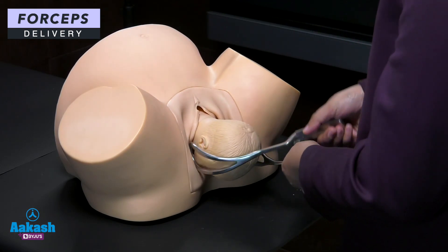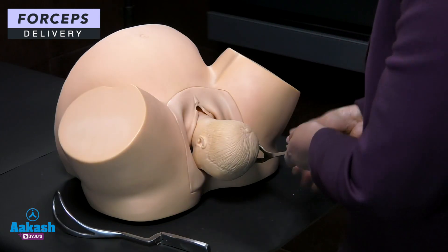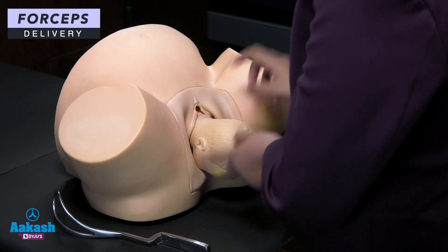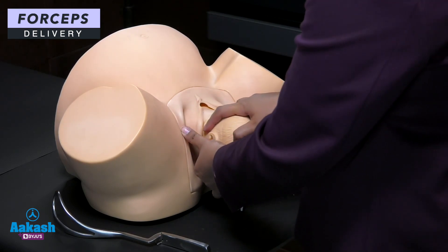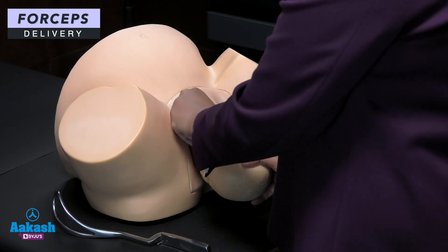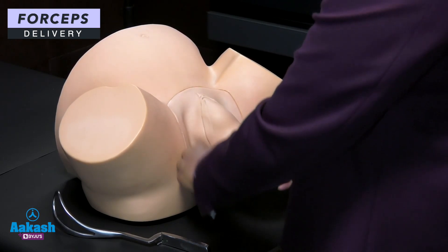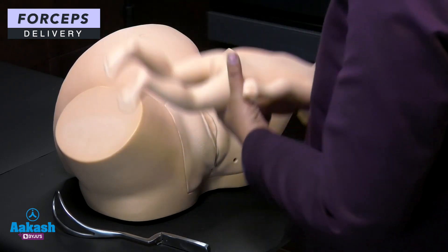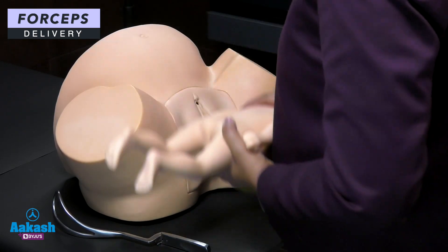The right blade is removed first, then the left blade. As the baby's head is out and the forcep is removed, we continue applying traction. The baby's shoulder will rotate — first the anterior shoulder is removed, then the posterior shoulder, and the baby is delivered. That is how we deliver the baby using forceps.